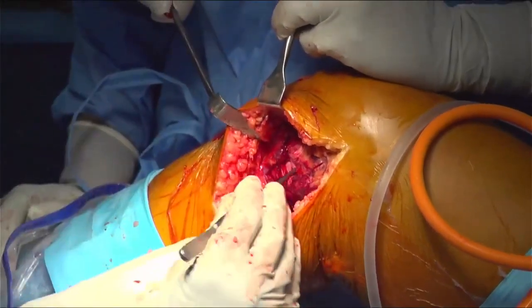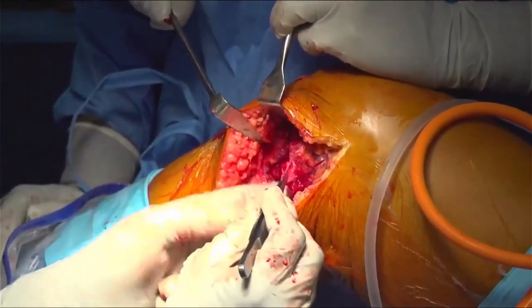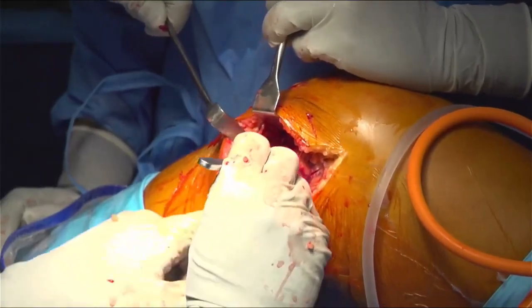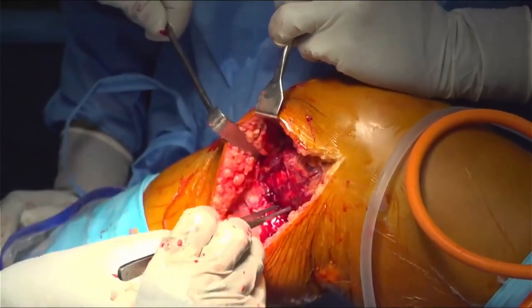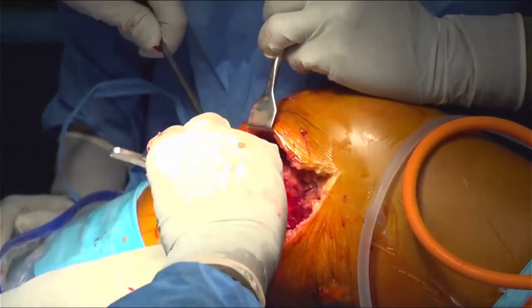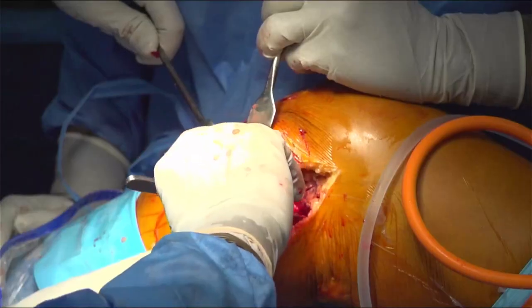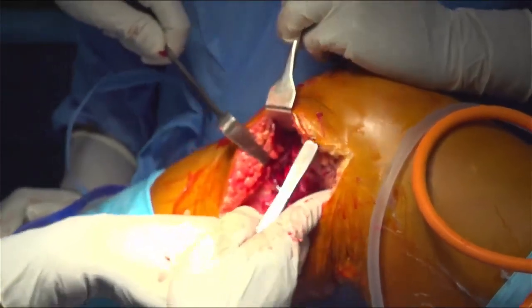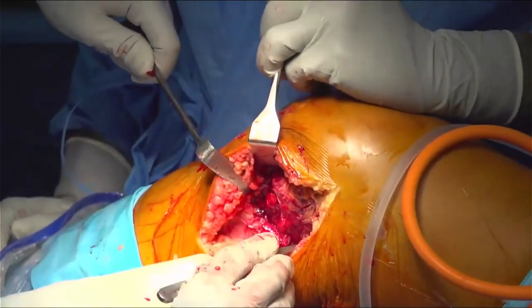This is the main meniscotibial attachment that is torn, and this is again a flap which has been torn. So probably we need to repair this one like this, and this one is the main issue which we need to address. This is probably the main part of the MCL which we need to address.